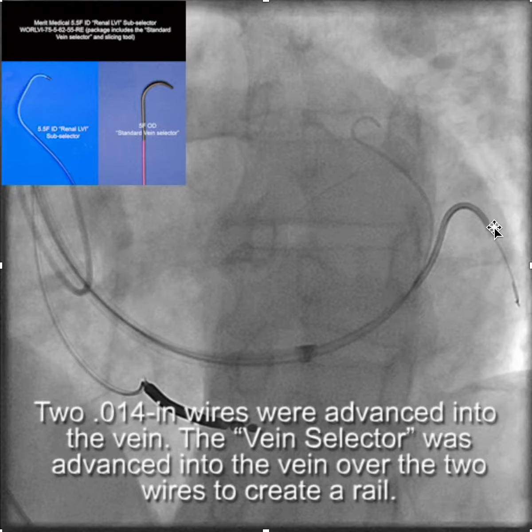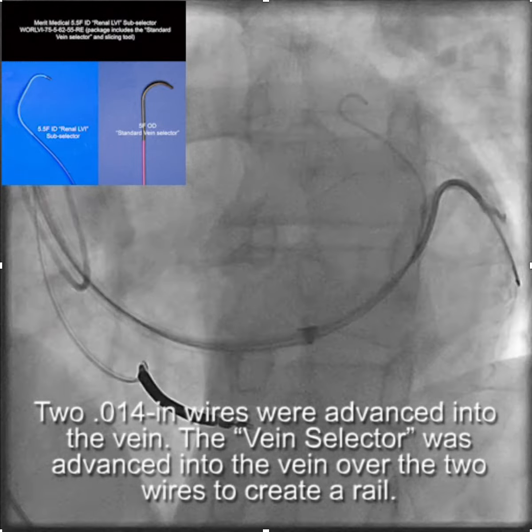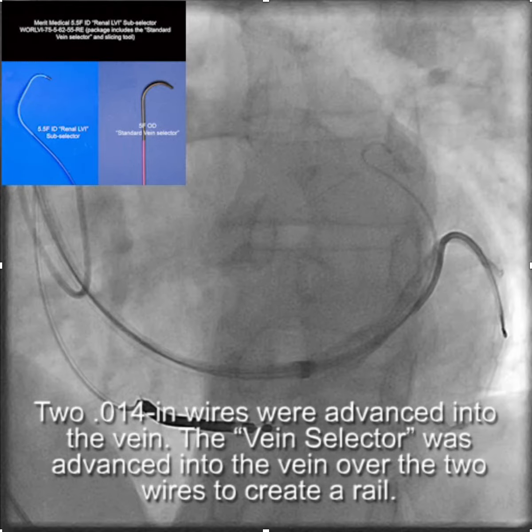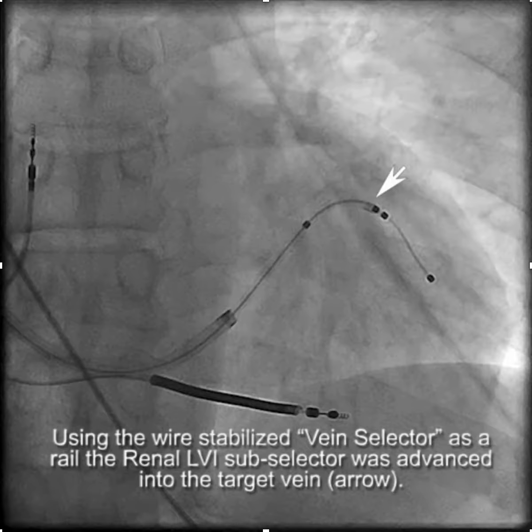We then advanced the vein selector over the wires as deep as we could into the vein to create a rail. You can see the wires and the vein selector deep in the branch. Then, using the wire-stabilized vein selector, we were able to advance the renal LVI subselector into the branch.